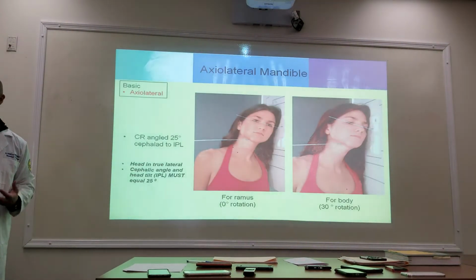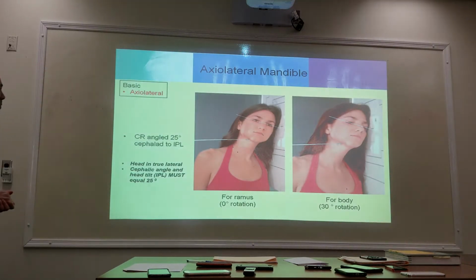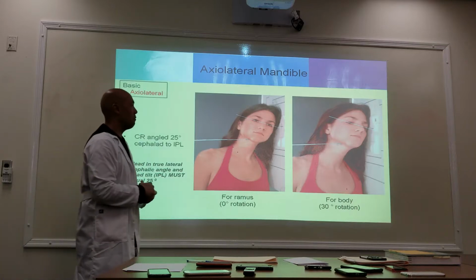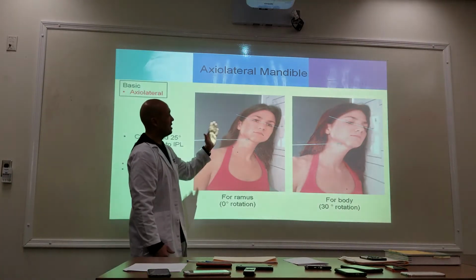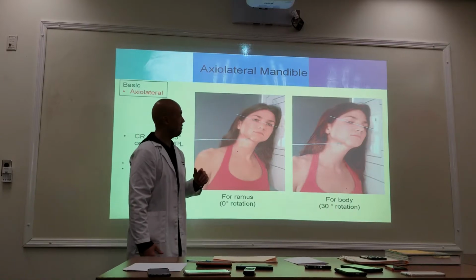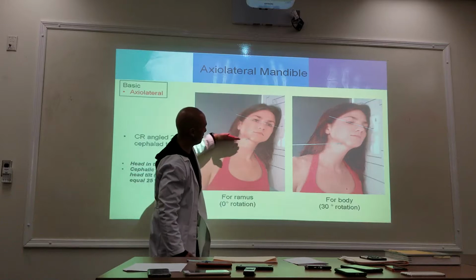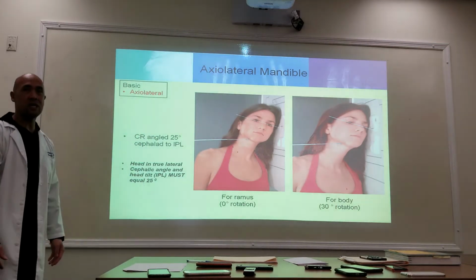Same views. Here we go. Axiolateral mandible. So what's going to happen here is from a true lateral position, the patient is going to tilt their head approximately 25 degrees. So this and this is 25 degrees. Okay, from a true lateral.